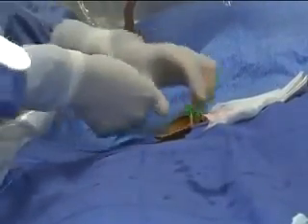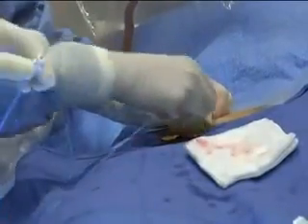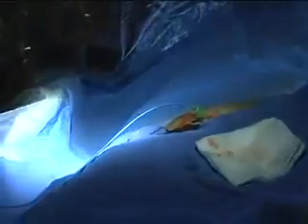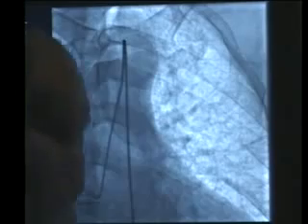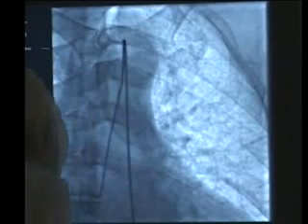The first catheter we place is called a pigtail catheter because of its shape. We are going to measure pressures inside the heart and outside the heart. The pigtail catheter is now outside the aortic valve, and we will now cross the aortic valve to measure the left ventricular pressure — retrograde with the pigtail catheter.